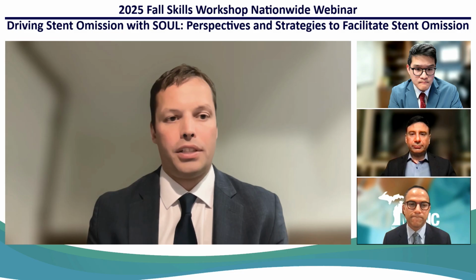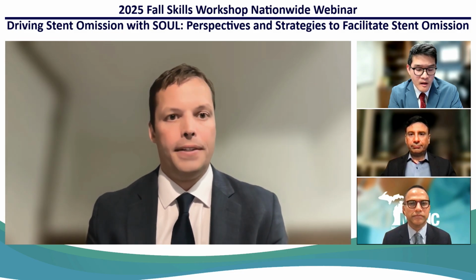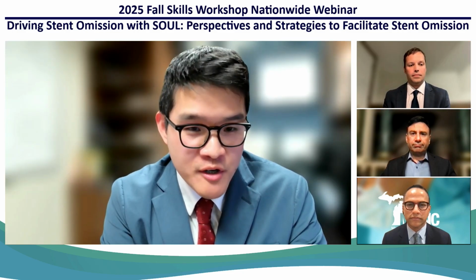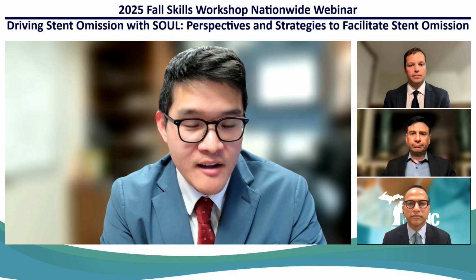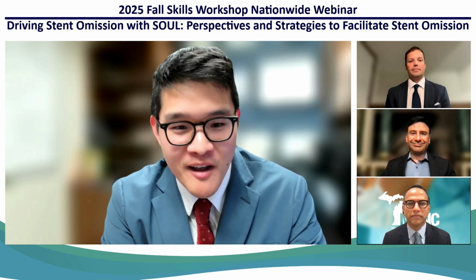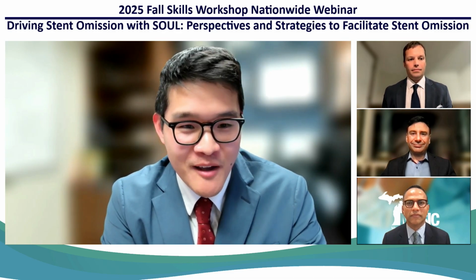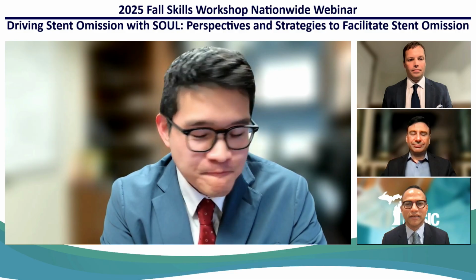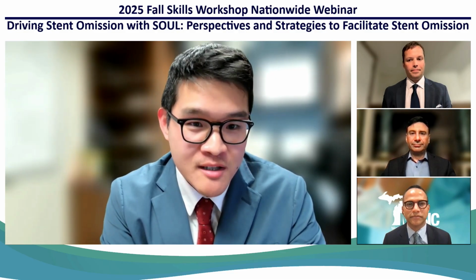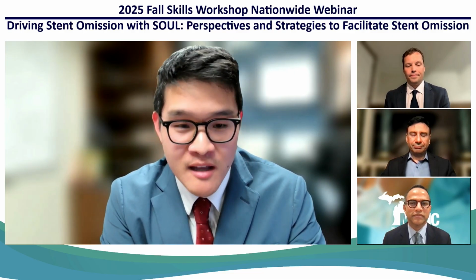Wilson, have you shared similar experiences with either the 6.3 French or 7.5 French disposable ureteroscopes? Yeah, I mean, it's interesting. When we first started using them here, a few of the residents said, "Oh my gosh, this is so light. Do we have to go back to using this other scope?" And I say, "Yeah, we should be environmentally conscious and do it." But I fell into just getting used to using more of the disposables. And part of my training, we used a lot of disposables too. And so it's hard to go back once you start using it ergonomically.